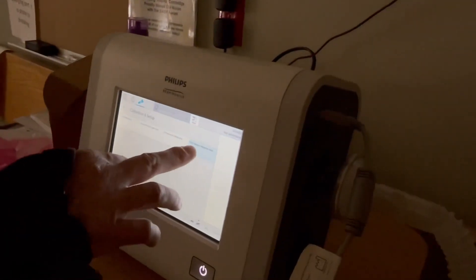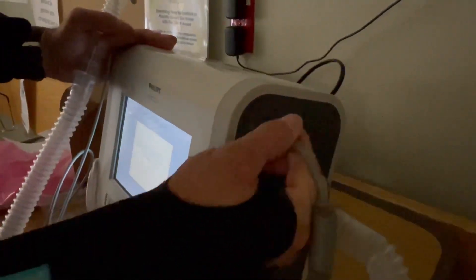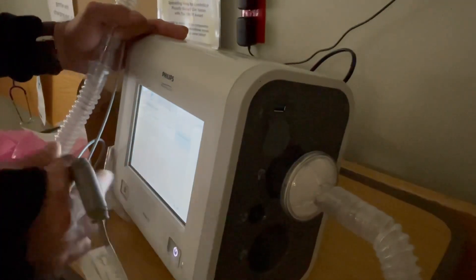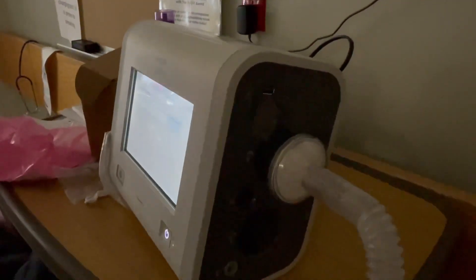Now it's not even reading CO2. It just worked — I swear to you, it worked like an hour ago. All right, let's try this again. I'm going to disconnect this.